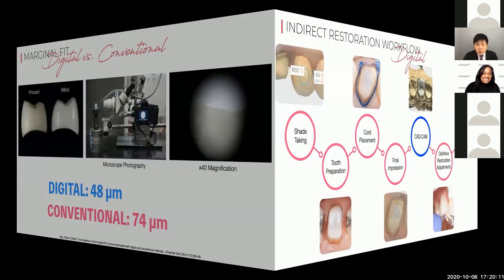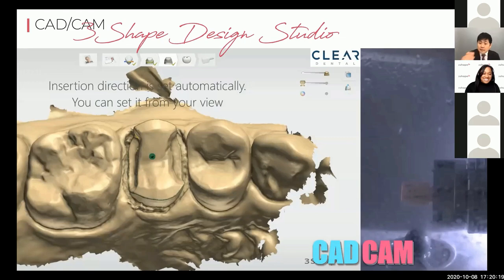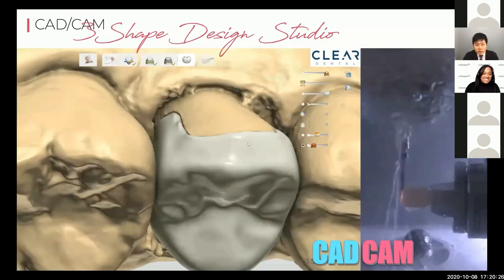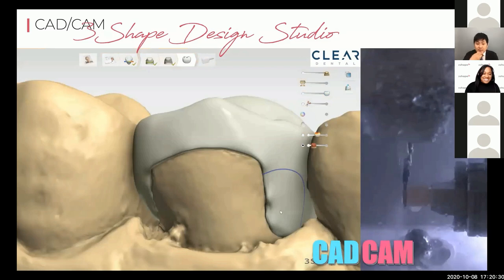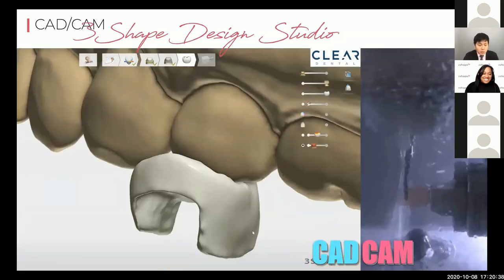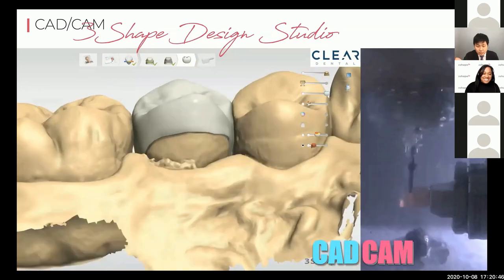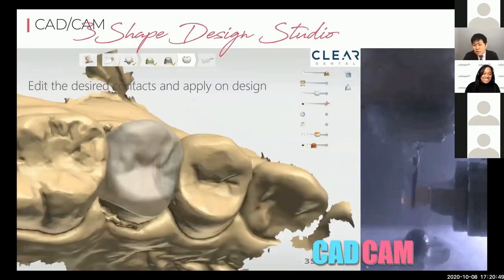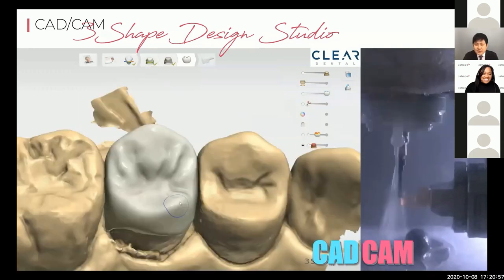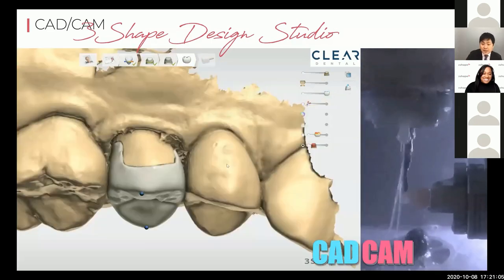Once intraoral scanning is done, we're ready to fabricate the restoration. The software used here is 3Shape Design Studio. Jack will go over this software in more detail and do a live demonstration. It's very user-friendly — it detects the margin quite well, and the auto design it produces is quite good, so there are not many changes needed.